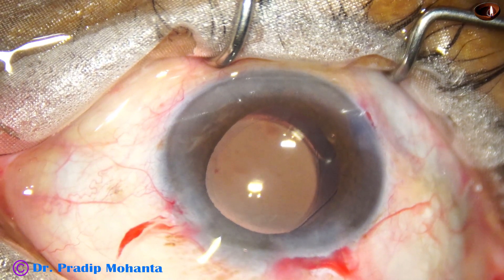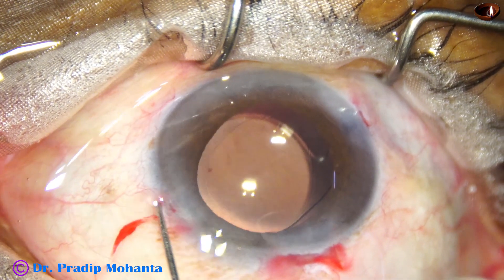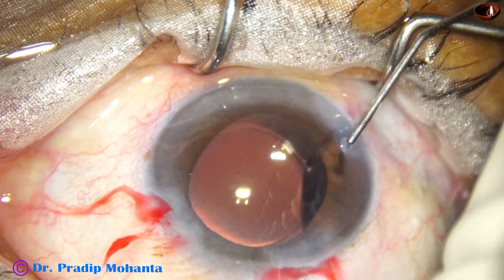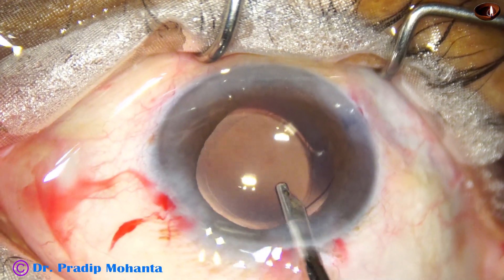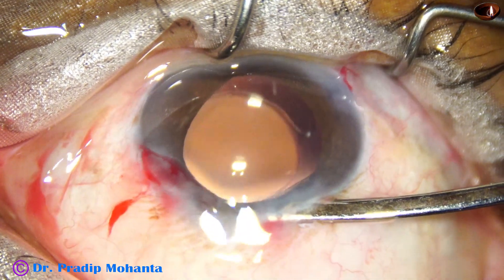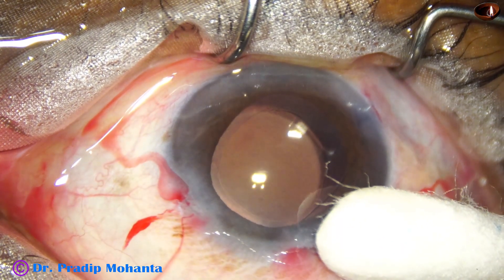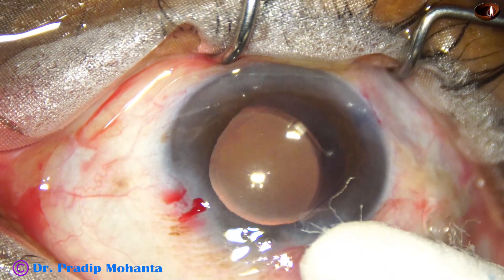This is moxifloxacin being instilled. The side port is closed and now a final lavage of the anterior chamber is done. Though this patient used Tamsulosin, because we pre-chopped the nucleus we could not make out that there is floppy iris. If we don't pre-chop, the iris keeps coming out while chopping and managing the nucleus. Thank you very much for your attention — hope this video will help you in managing such cases.